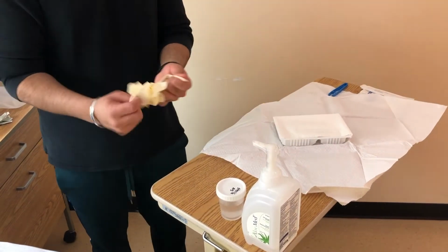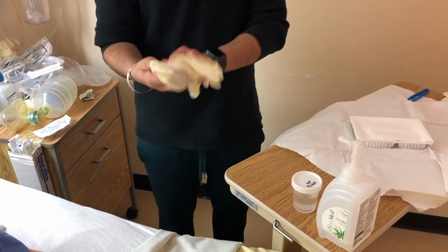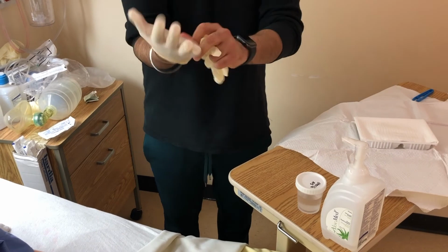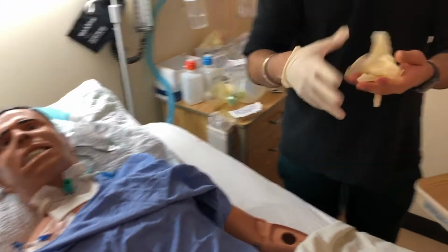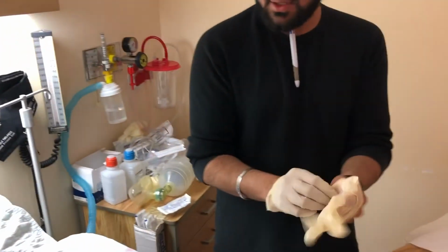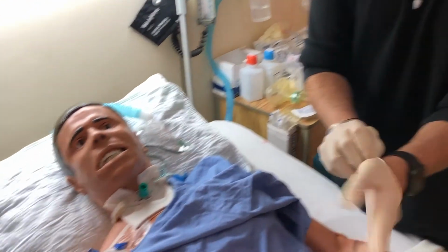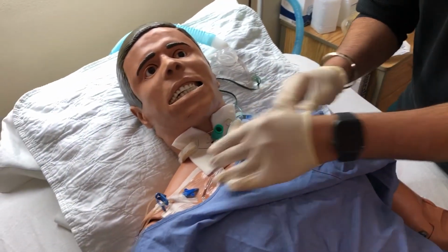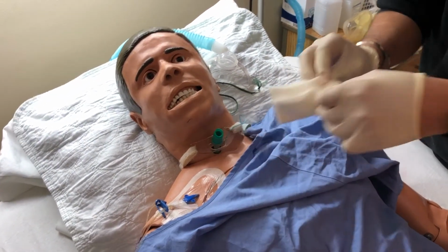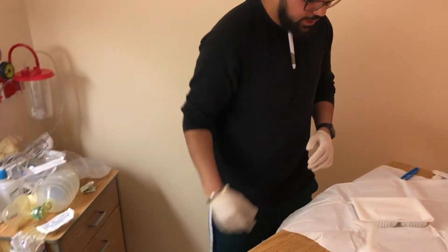I would put gloves on at this time, and I would take my old dressing out, assess the stoma that's there to see if there's any signs of irritation and if it's healthy. This would be garbage, which I have right there.